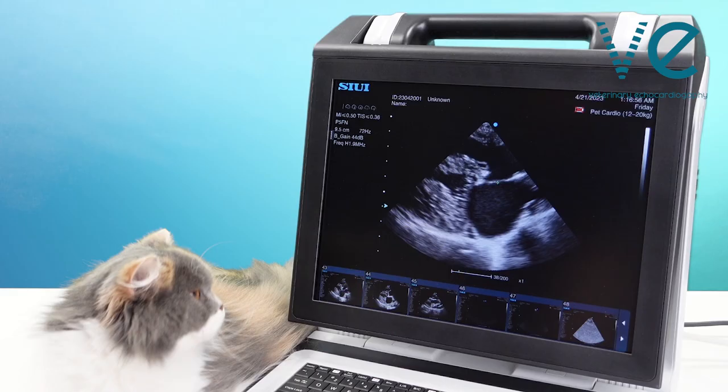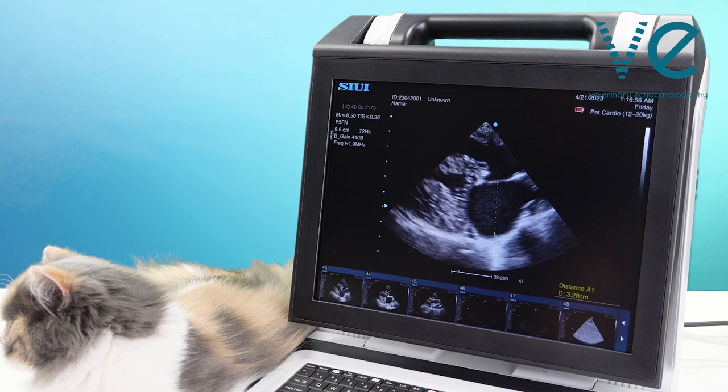Obviously we do measurements. Measuring the LA to AO from the short axis view is easier in cats than it is in dogs, but I think everybody has difficulties assessing the LA to AO because of variations in exactly where you put the cursors for left atrial diameter. So I probably tend to eyeball the LA to AO ratio, and for the long axis view measure the left atrial diameter from the interatrial septum to the far wall of the left atrium in a line that bisects the left atrium into two equal halves.